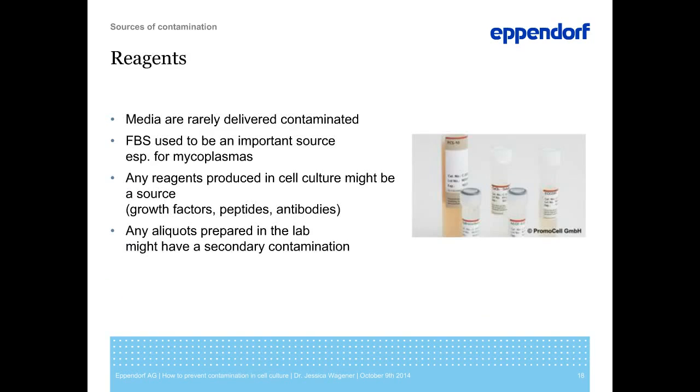Let's move on to the direct source, the reagents. We use a broad range of reagents in cell culture. Media usually are rarely delivered contaminated nowadays. They are sterile filtered, and it happens very randomly that you receive them contaminated. FBS is a different story though.